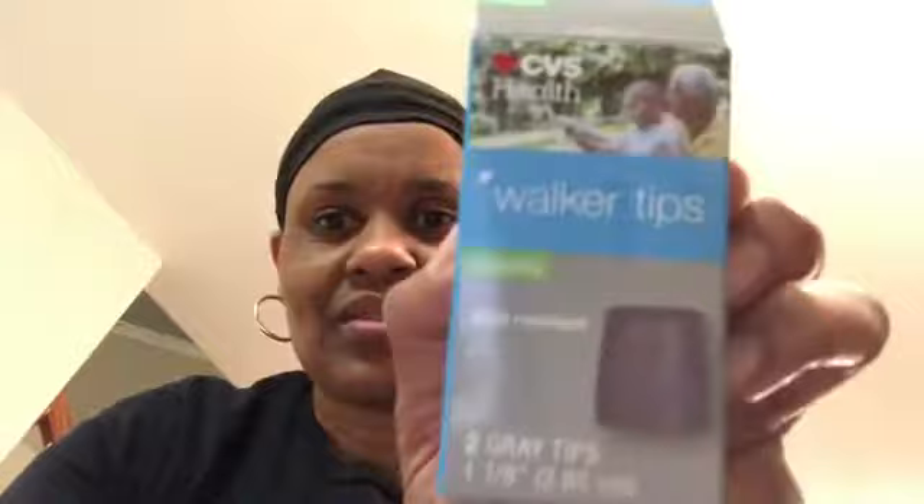Hi everybody, it's your girl Allie. I just got back from CVS where I picked up some stoppers for my mother's walker. This video is going to show you how to install these new stoppers on a walker. I call them stoppers but they're walker tips. She has a drive walker and we're about to put some new tips on it. They can be purchased at CVS for about $4.99, and you can also get them online.